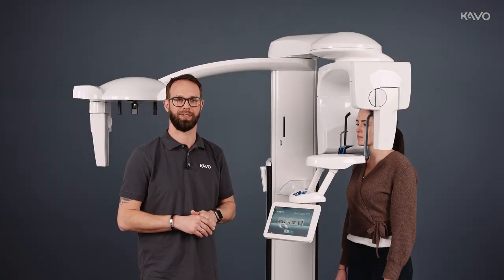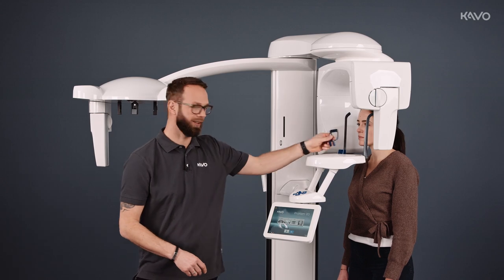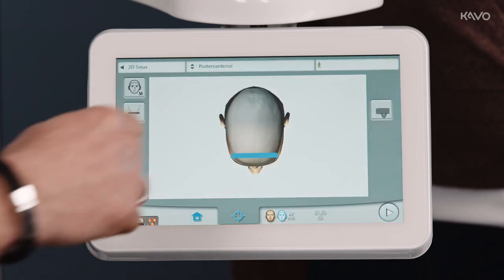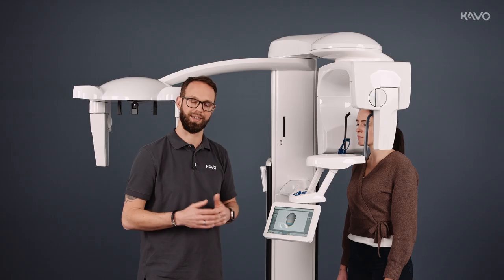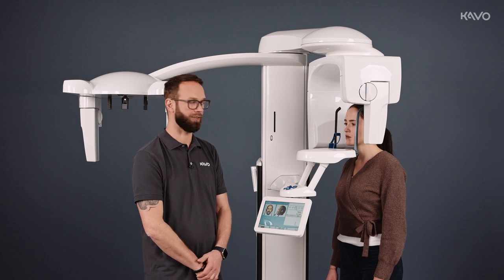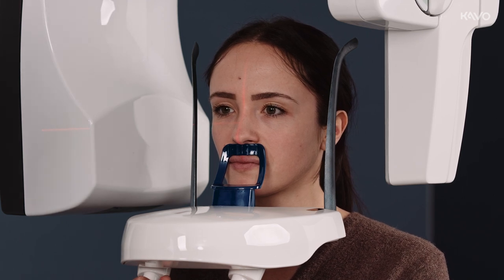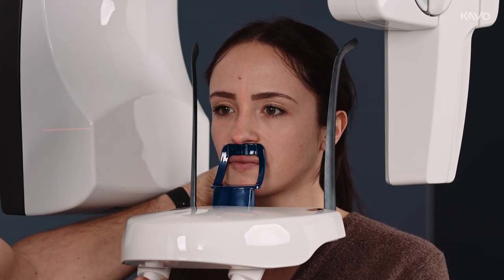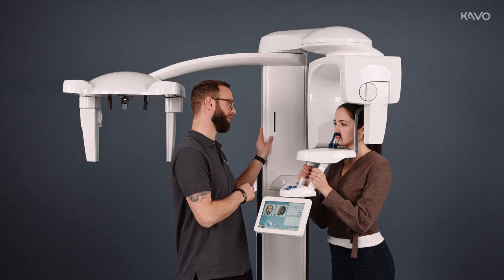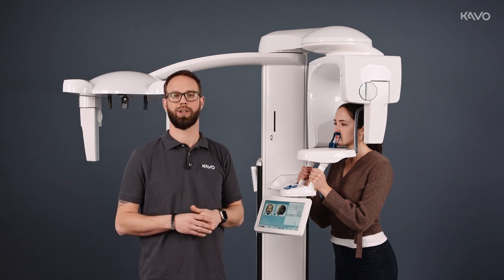To take sinus images with ProExam 2D, we remove the bite block and attach our sinus holder. We press the sinus program on our display, select the patient type again, and go on to the positioning level. For sinus imaging, we position the equipment below the nose on the upper lip, turn the head to the middle, close the temple supports, and position the Frankfurt horizontal. The K9 laser is not required for sinus imaging.